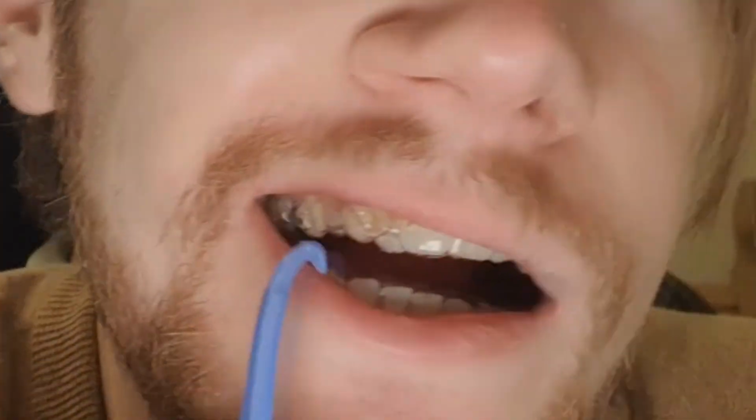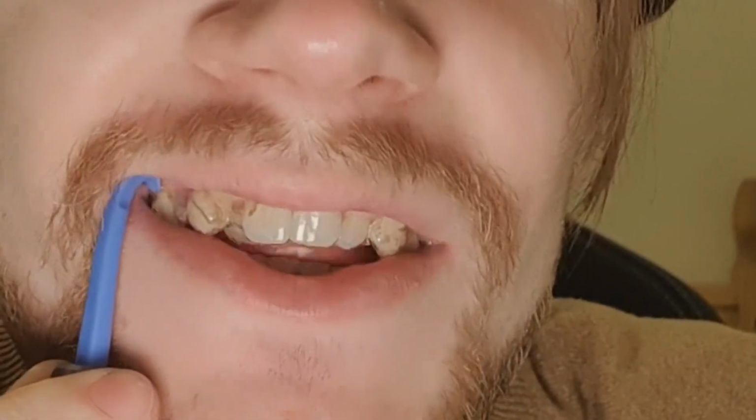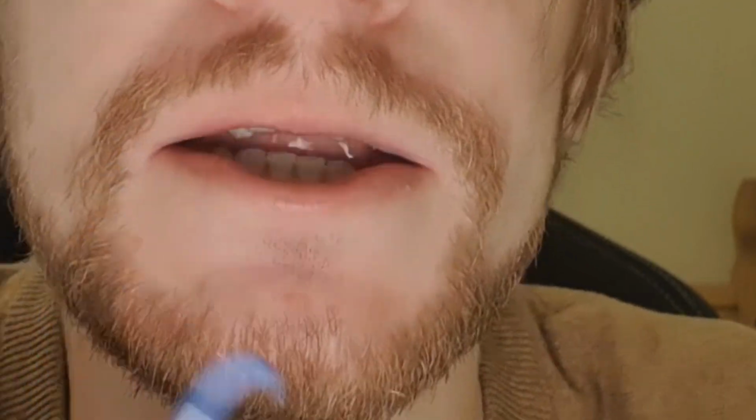There's a knack to using these. It's not just a case of going in and pulling. Eventually you'll work out very specific places on your aligners that are appropriate to pull with these tools. There's going to be specific spots that are difficult to remove, and there's going to be a certain way of pulling it and a certain angle that you will figure out. So for me, I only use this on this corner, on this canine, and then on this premolar behind it. I just help it over the attachments just to avoid breaking them off, really.